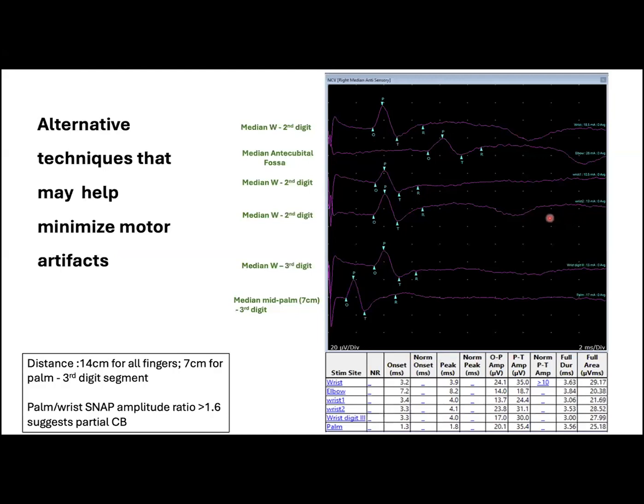Here we have additional recordings from the same patient, who appears to be very slender, given the relatively low electrical stimulation intensities. The first tracing here represents a median snap, with stimulation at the wrist and recording at the index finger, and the second one here when stimulated at the anticubital fossa.